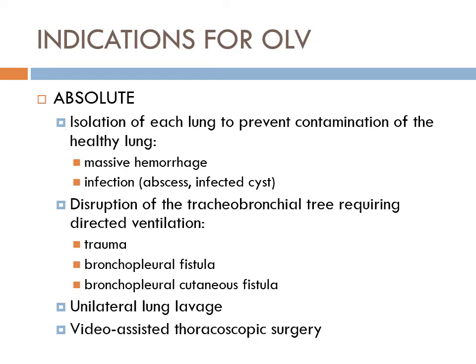One way that we sort of guess what the pressures are, or tolerate whatever the pressures are, is that you put your tube in and confirm that you're in, that's the most important thing. Bag, bag, bag, bag. You blow off all the CO2 that would have been in the stomach. If you went to the stomach, there could be CO2 in there because you were ventilating them before and blowing CO2 into their stomach. But if you ventilate them a bunch of times quickly and you see it on your capnography, it goes away, then you're like, okay, I'm really not in the lungs.